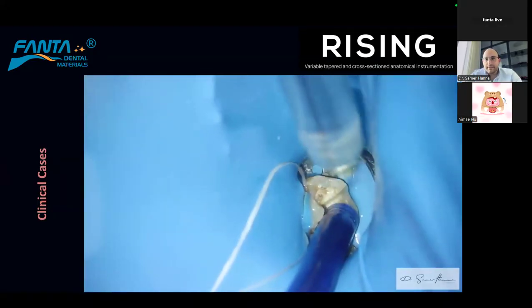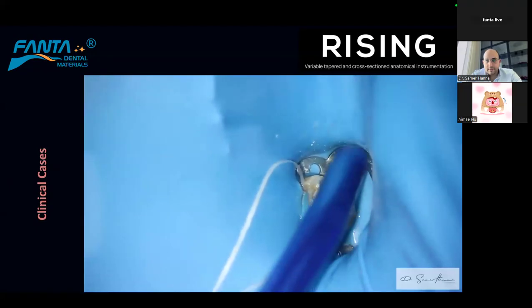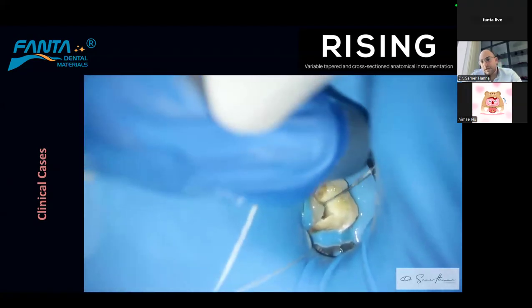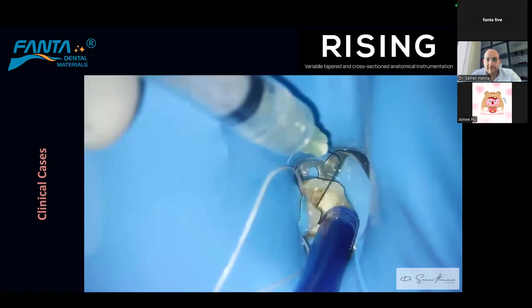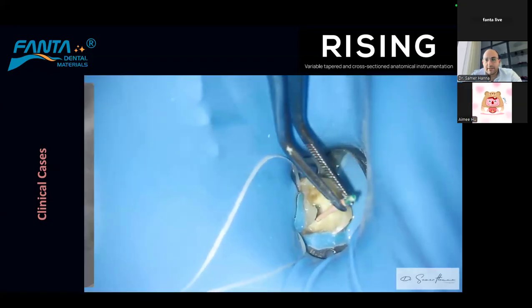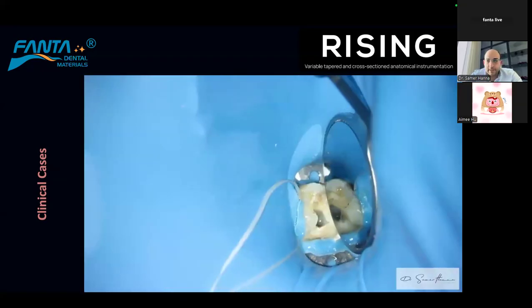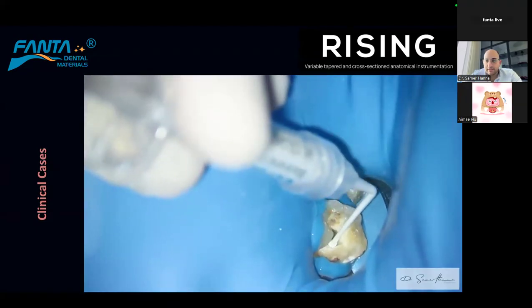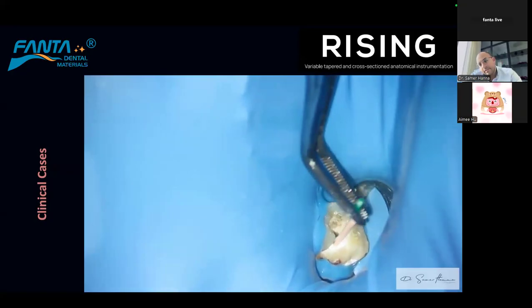Irrigation. And show you now ultrasonic activation, which is very, very important in all cases. I'd never end the case without using it. GP fitting. We can see the GP master cone fit and using bioceramic sealer, injecting the bioceramic sealer inside the canal, GP cutting with System B.